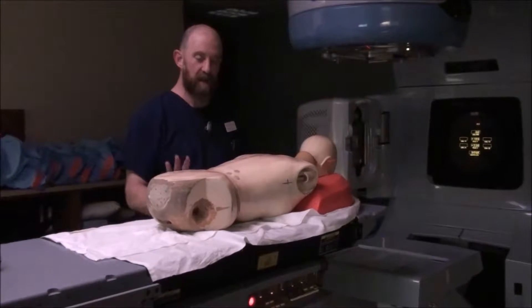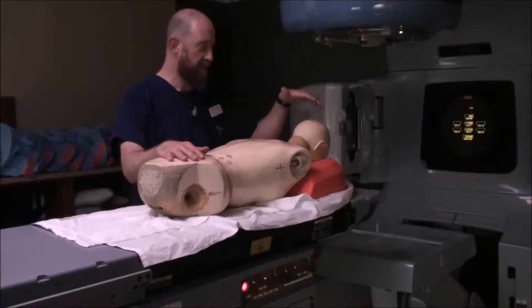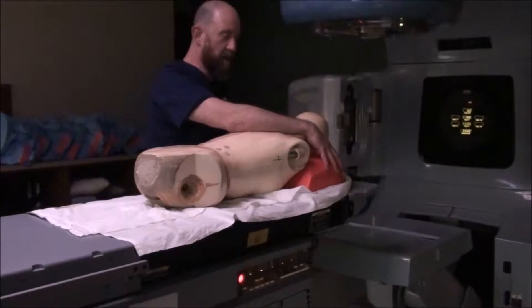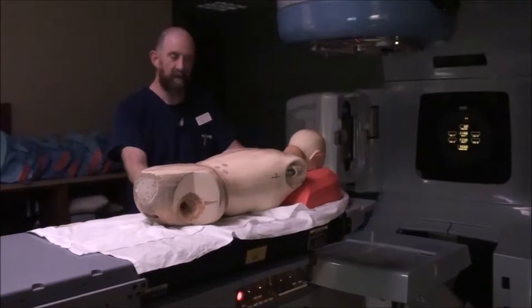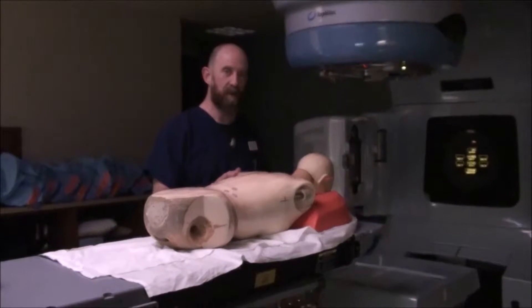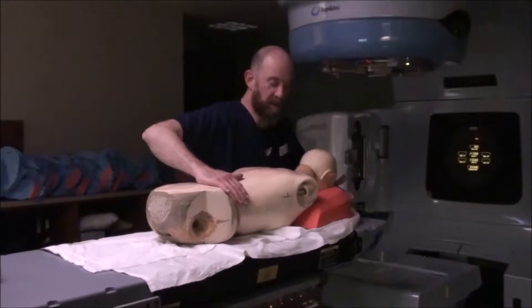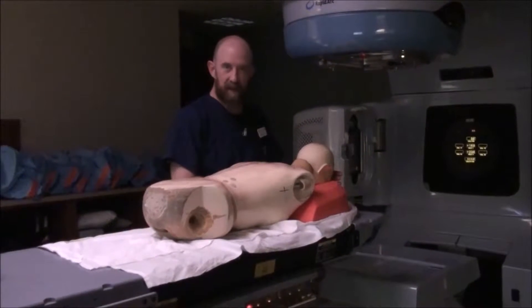When you get a patient prone, as we discussed last semester, you want to have something relatively comfortable for their head. This is our prone pillow. Not every prone pillow is the same, and not everyone has or uses a prone pillow. But if you do use one, make sure they are positioned on it properly. The slope of the prone pillow should fit against their chest, and their forehead should be near the top.